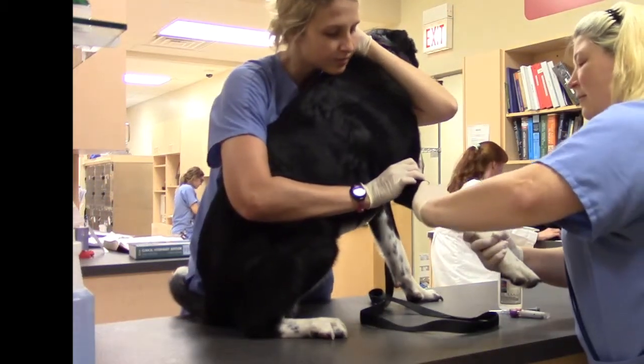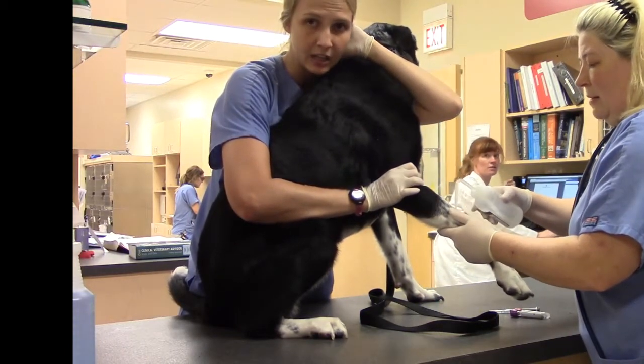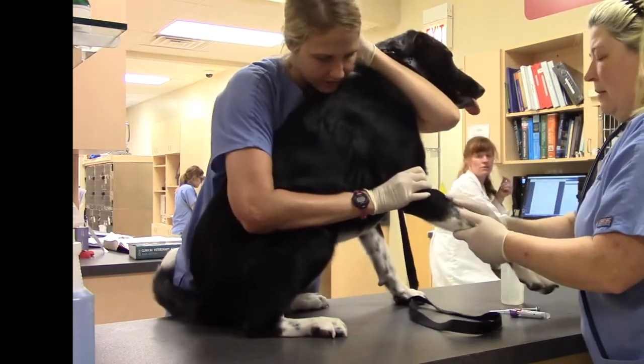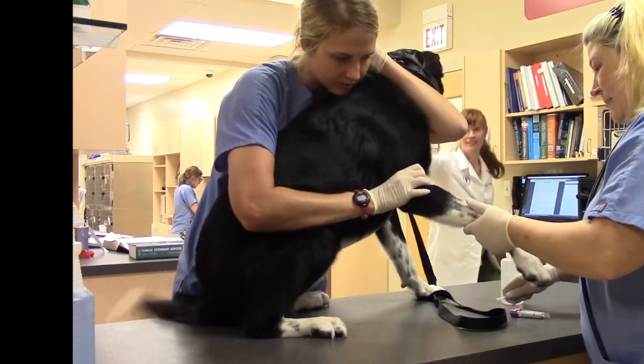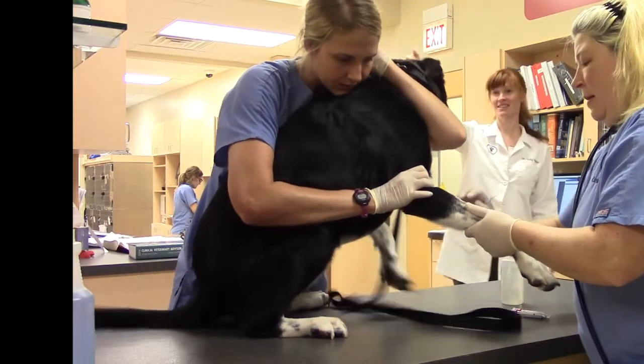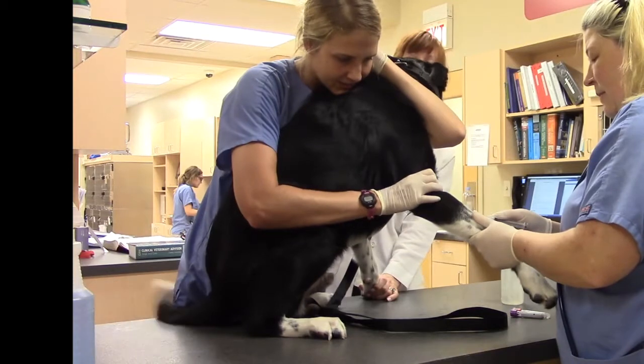Sarah's occluding the vessel. Marley is doing nice. I've got his head where I'm holding it where I can control it, where he can't get to Caroline or me. I think he's still comfortable. It's okay. Inserting bevel up.